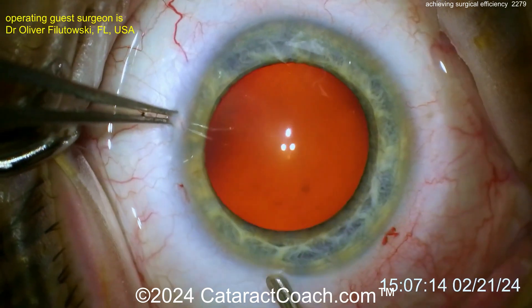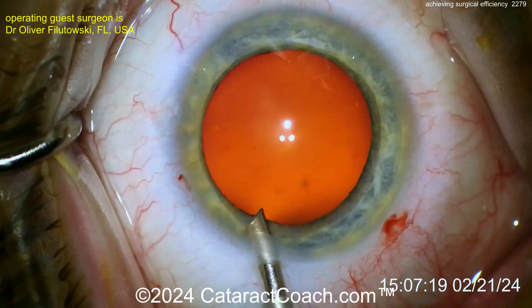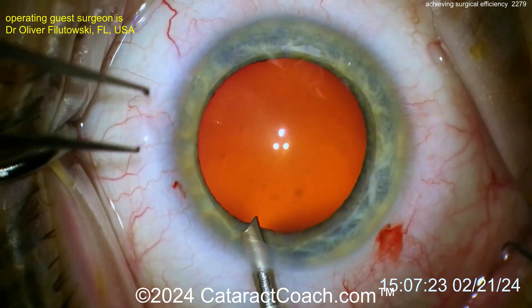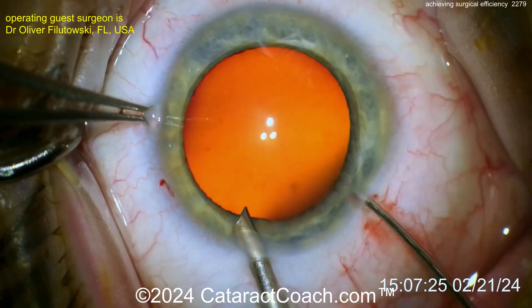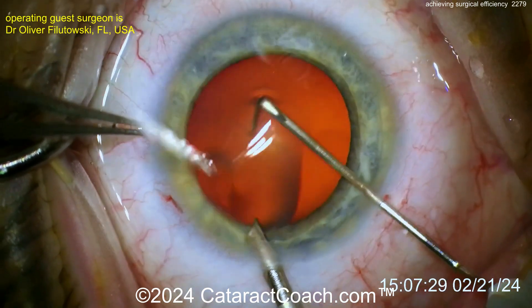We're going to watch this case to see how efficient it is. Now here comes an AC maintainer — that's a little bit different compared to most surgeons. Doing a REXIS without viscoelastic and just using an AC maintainer is actually more difficult. The reason is the caps will float around a lot — it'll flap around in there.